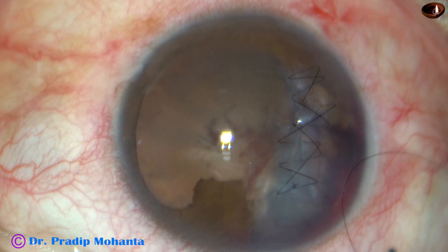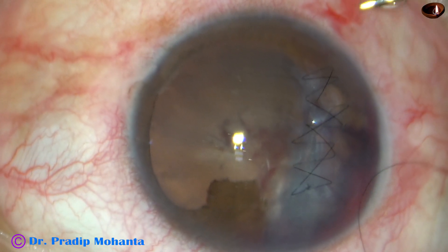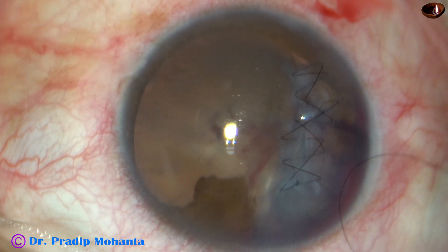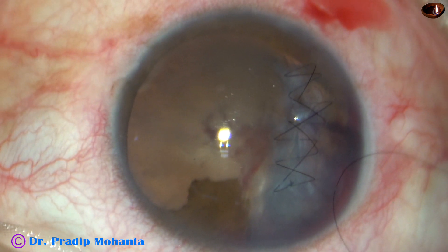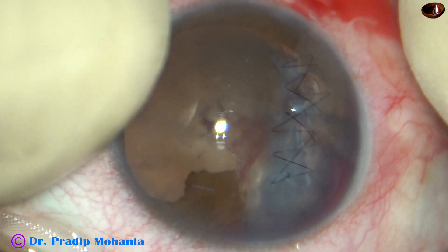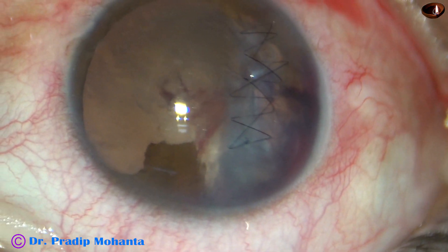Now this is Moxifloxacin again in the wound. And now this is hydration of the stab incision, and some amount of Moxifloxacin has gone into the anterior chamber. I find that the intraocular pressure is normal and conclude the case.